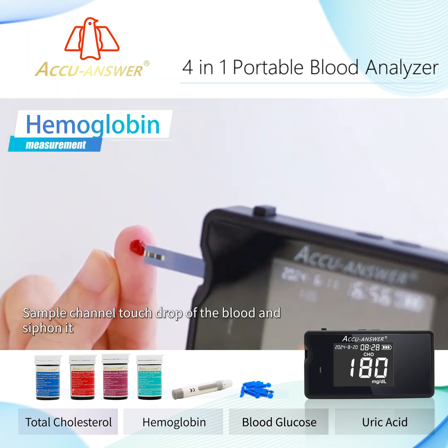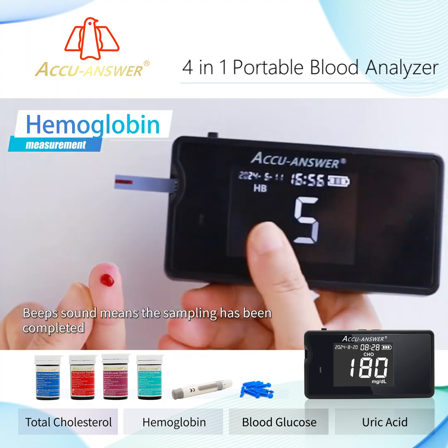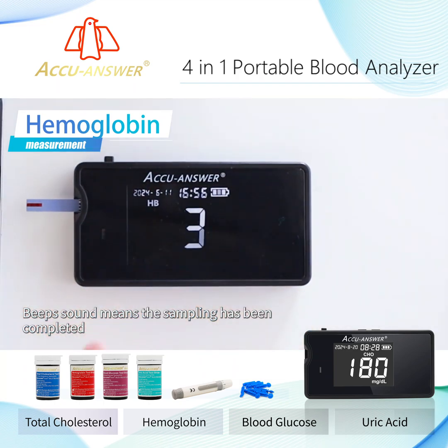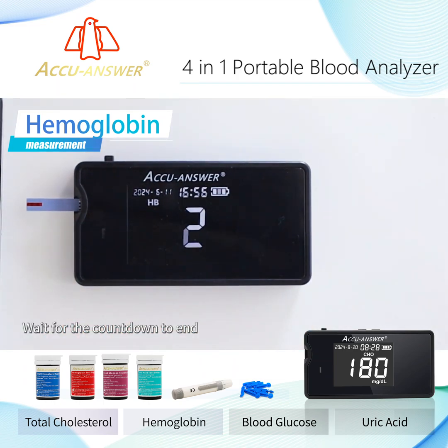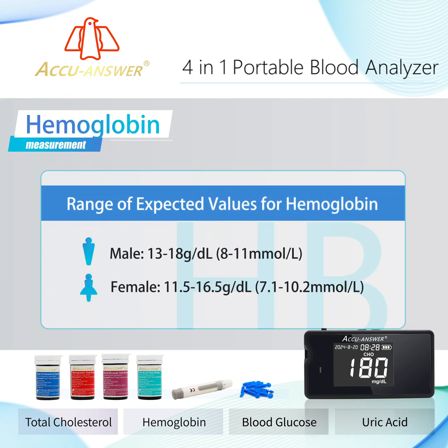Apply the sample — the sample channel will touch the drop of blood and siphon it in. A beep sound means sampling is complete. Wait for the countdown to end and the meter will display the results. Range of expected values for hemoglobin.